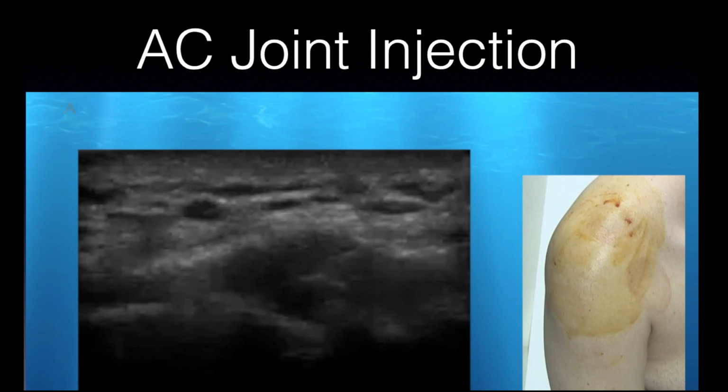I usually put the pink needle, the 18 gauge, on the lidocaine, because that's what you're going in with, and then the other syringes, it doesn't matter what needle you have on it because you're not going in with that needle. So you don't have to change out needles on the other syringes because you're not going in with that.